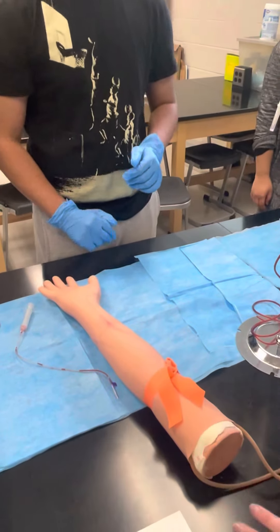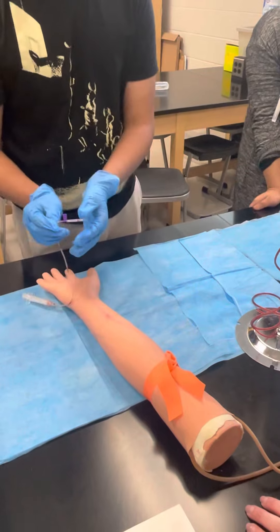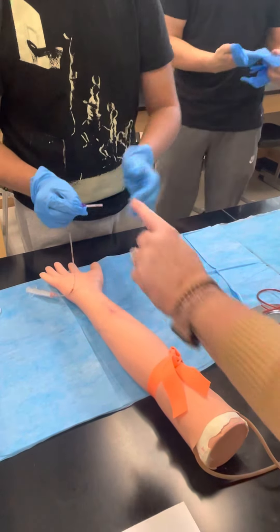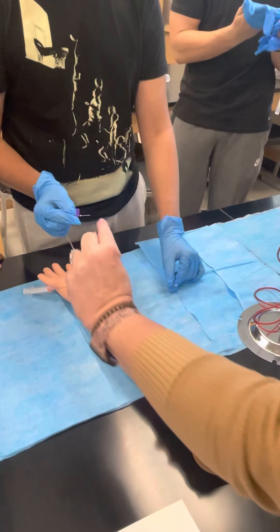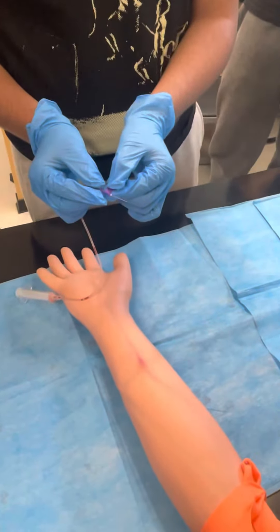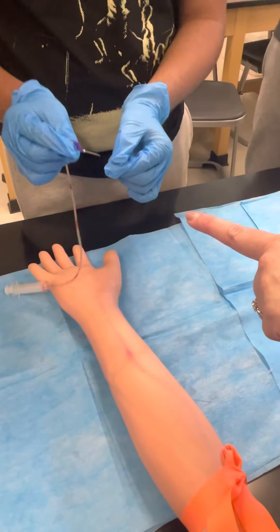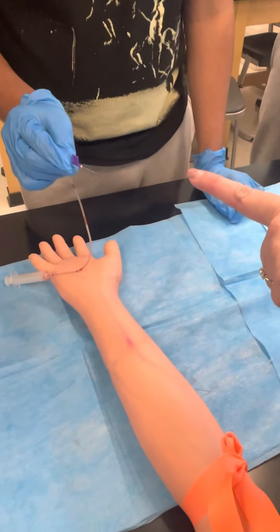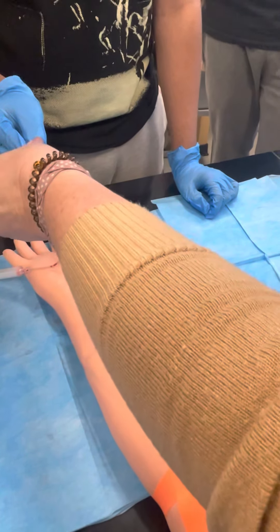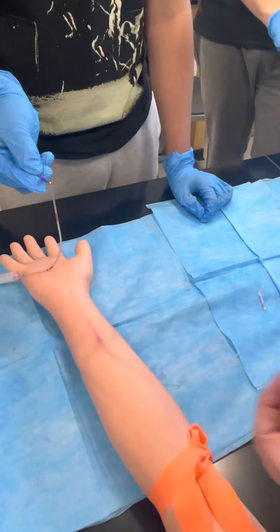While he's getting those, I'll walk you through. You're gonna take the cap off of your needle carefully — don't touch the needle, just pull the cap off. Now the bevel of the needle, or the opening of the needle, needs to be facing up. Turn it even a tiny bit more — it's gonna make it a lot more comfortable when it goes in the patient's skin.